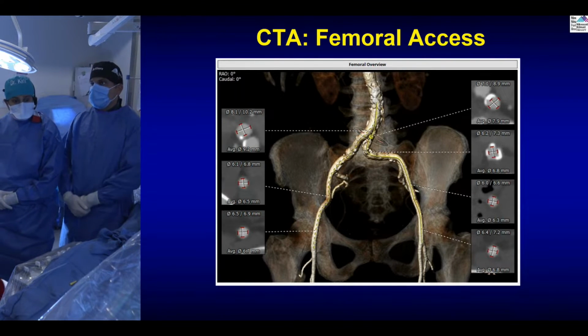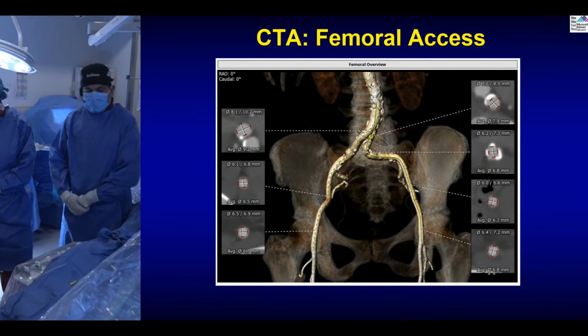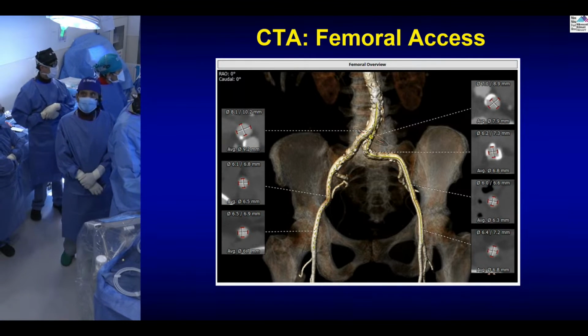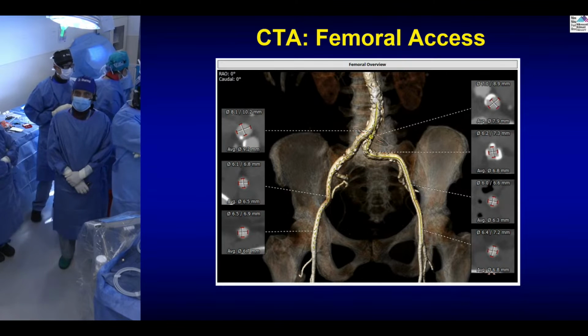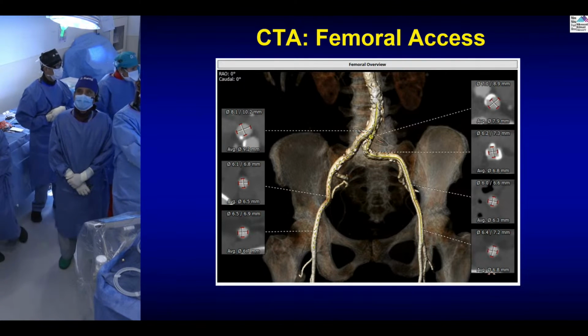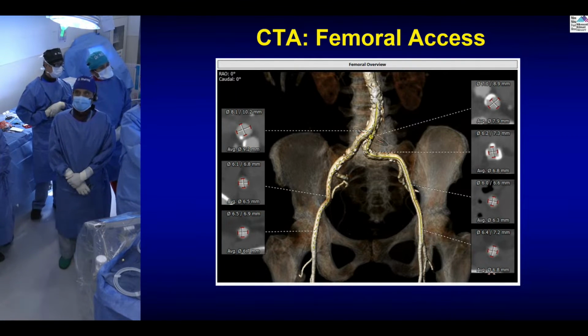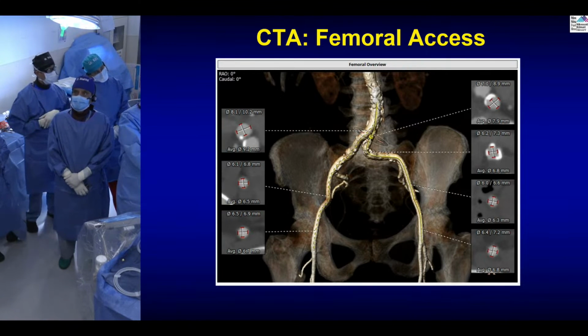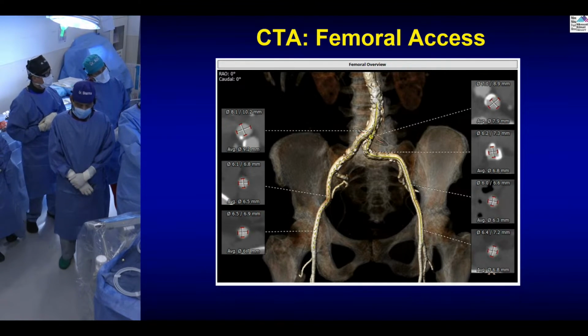So we have done a staged approach, actually. Yeah. Some of the very high-risk patients, that's a redo TAVR. In fact, your patient, Dr. Moreno, if you recall, we actually did a balloon first, but then obviously the valve also degenerated, and we had no choice but to do it. And we were quite successful. But you're absolutely right. You don't have to do it at one time, if you worry that putting in a second valve will jeopardize and harm the patient.